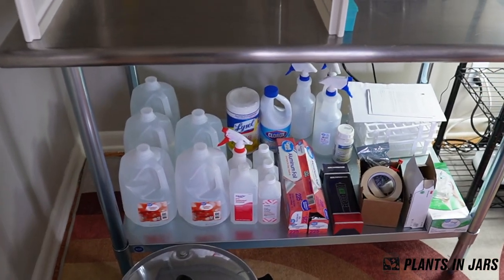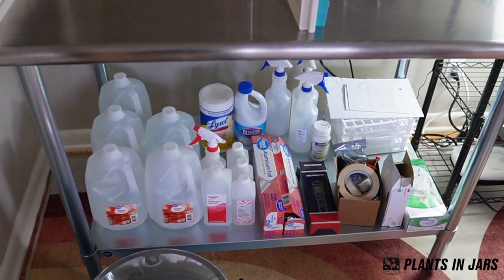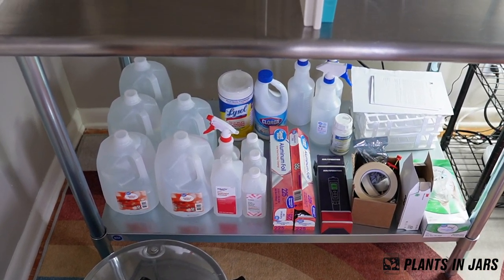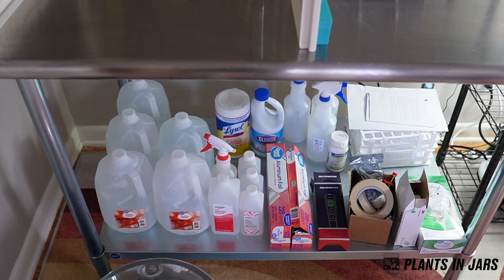I buy distilled water from Walmart for my tissue culture, so that's why I have so much of it there. And then I just have the cleaning stuff: ethyl alcohol, isopropyl alcohol, bleach, and aluminum foil.